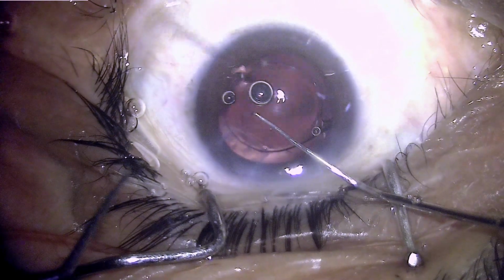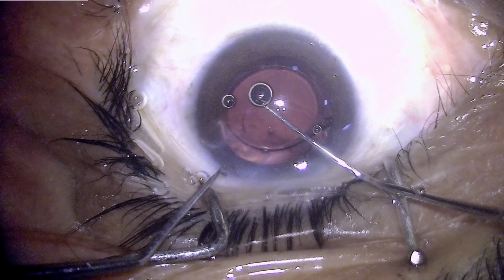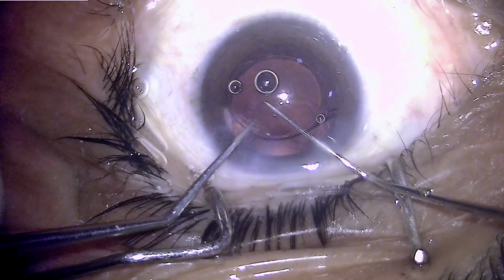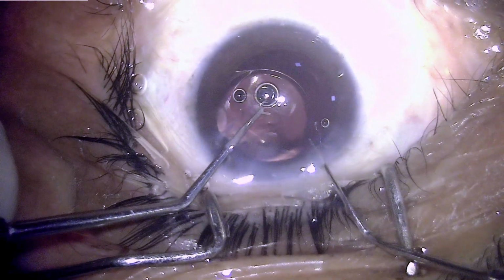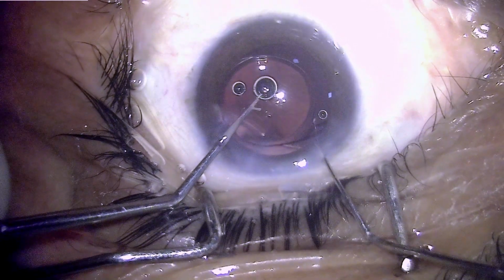So what we will need is to pull out this haptic from the sulcus, and then push it back in correct orientation. And this is the procedure how it can be done.